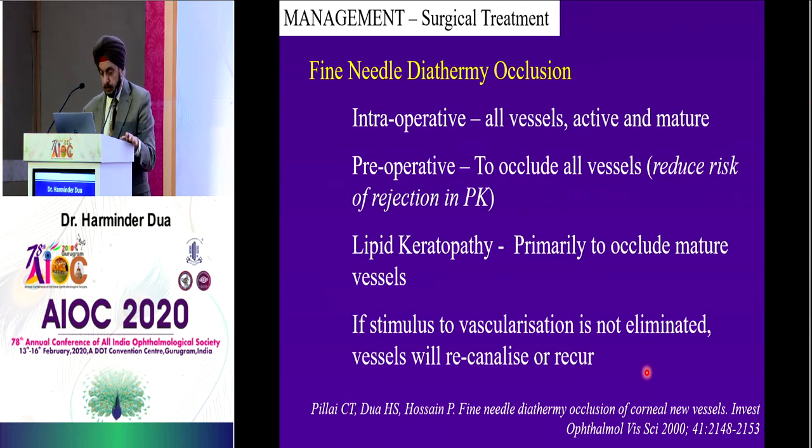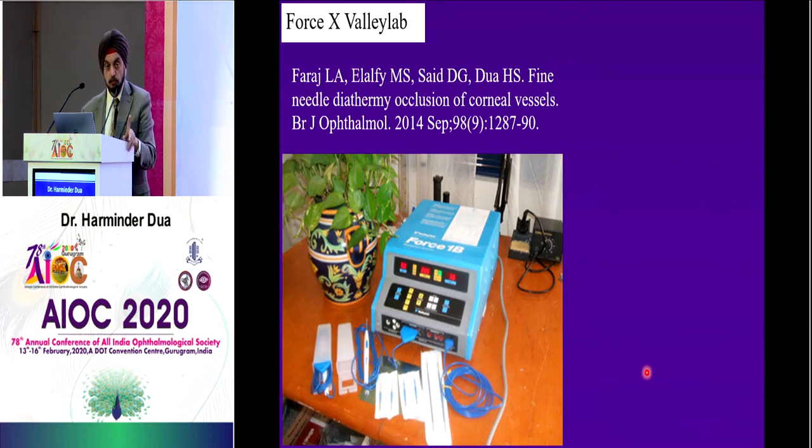So here is what we do in fine needle diathermy. You need a monopolar cautery, not a bipolar that you use to stop the vessel.